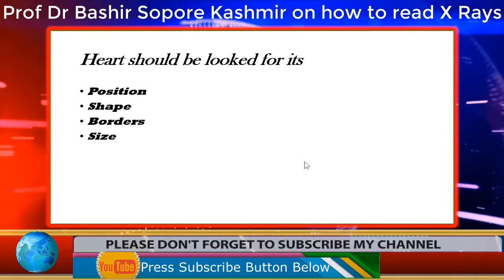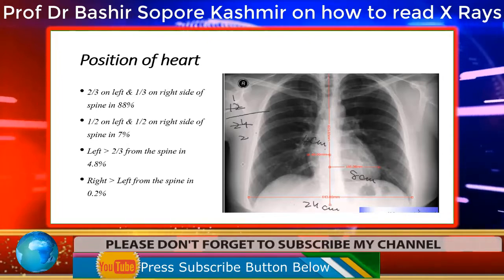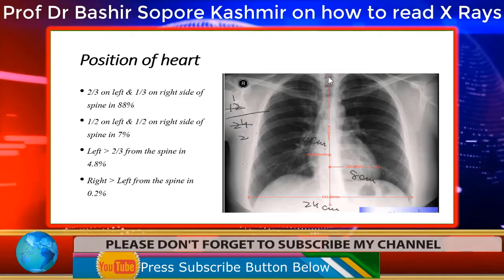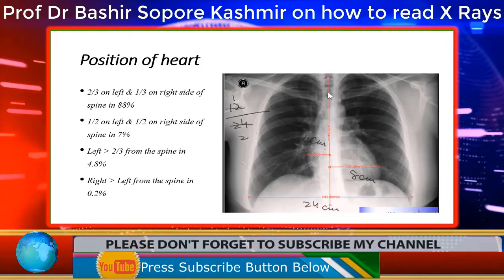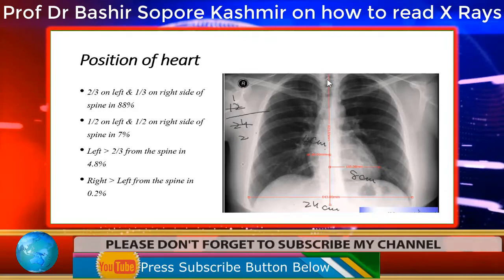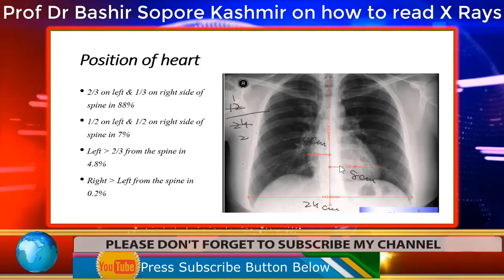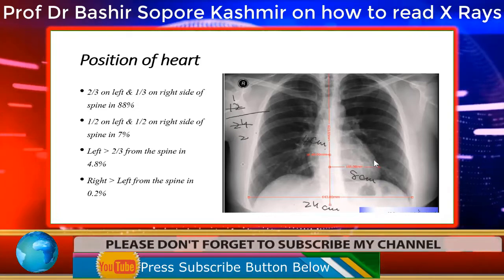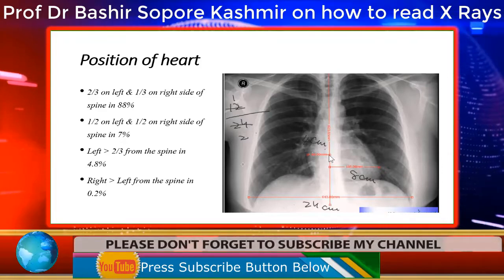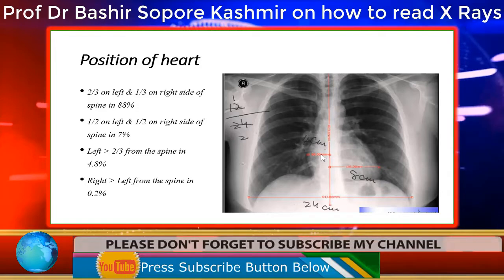Now let us talk about the position, shape, borders and size of the heart. So the position of the heart is that it is 2/3 on the left side. So if you draw a line in the center of the spine like this vertical line, and from this midline in the spine, if you measure the distance from here to the maximum distance of the heart, this will form the lateral 2/3 of the heart. And if you measure from this point to the maximum distance of the right atrium, this forms the 1/3 of the heart.